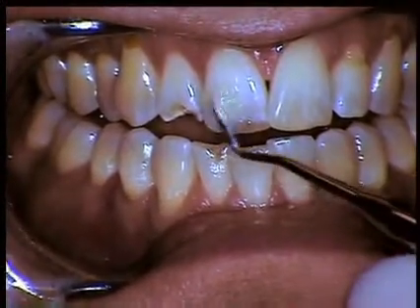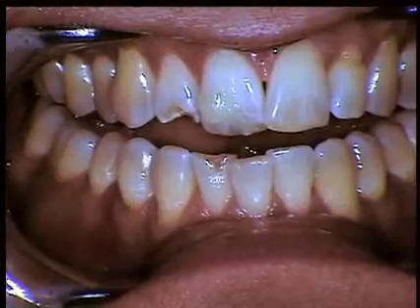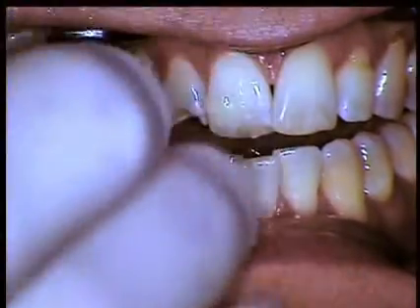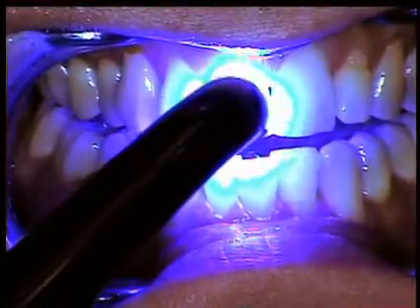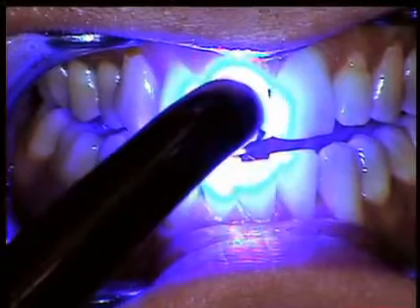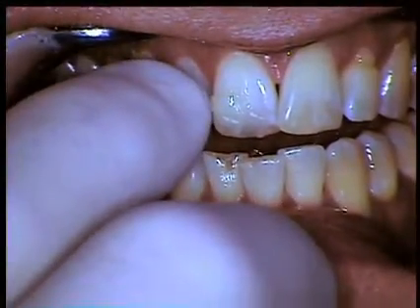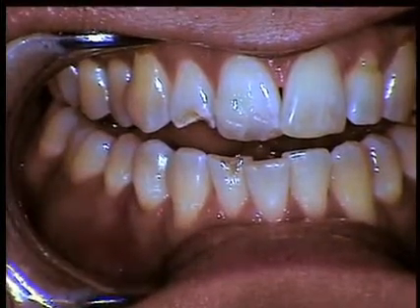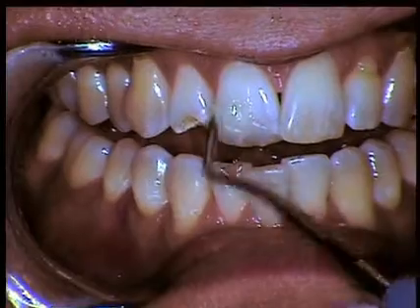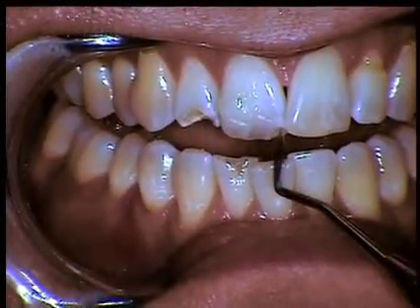I'll also express a little bit of the incisal translucency material, since he has some incisal translucency, to get an idea of how much we'll need. I'll light cure this for about 10 seconds, then step back and look — sometimes it's amazing how shade values change when the patient leans back versus sitting up. We can see the body shade is very similar to what we're looking for in the central portion, though we obviously don't need quite that much translucency. We may also need a little opaque color for number seven, since there's more tooth missing there than just the small edge on number eight.